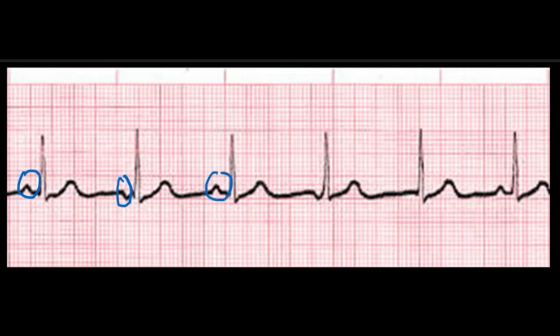It's a little tough to tell whether or not this here is a P wave, but you can tell that it kind of goes up a little bit. So this almost looks like it's a P wave compared to this, where there's probably a P wave missing here, and then we come back into a P wave. So yes, P waves are present.